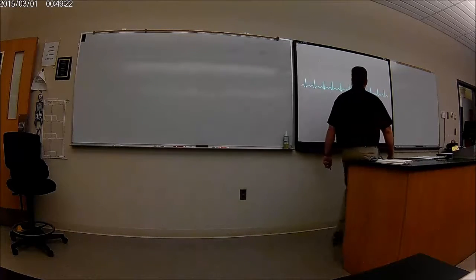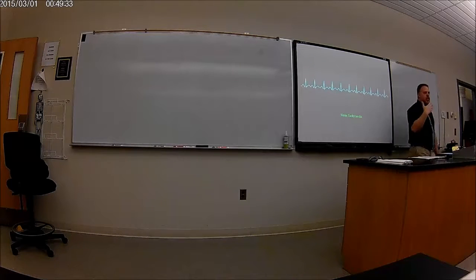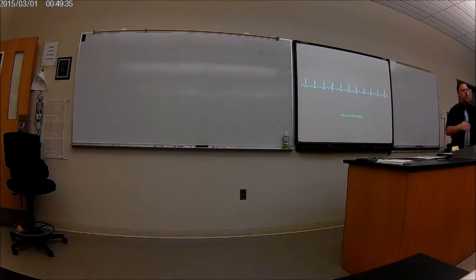So this is sinus tachycardia. If you count these, it's going to be like about 100, 150. But there's a P, QRS, P, QRS, P, QRS. So therefore, this is sinus, and because it's going so fast, sinus tachycardia. Okay?